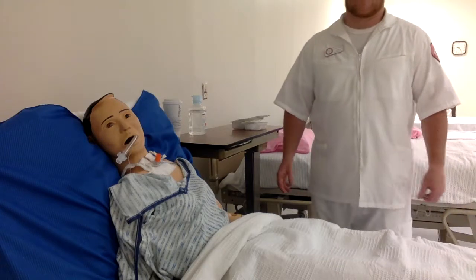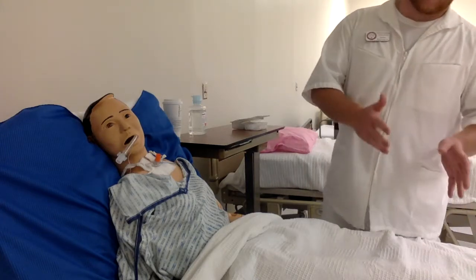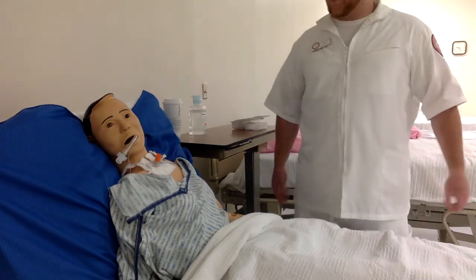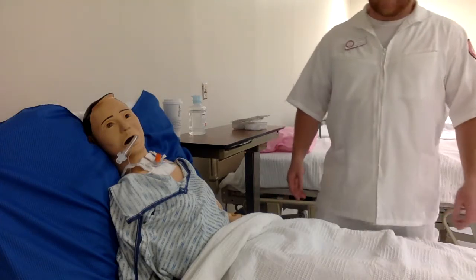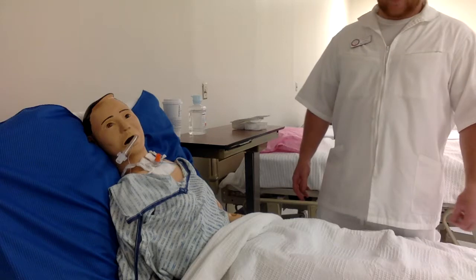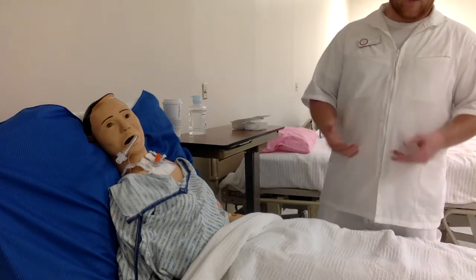This is a sterile procedure. When you actually start and wash your hands, you should be using sterile technique from that point. With that said, let's get started.